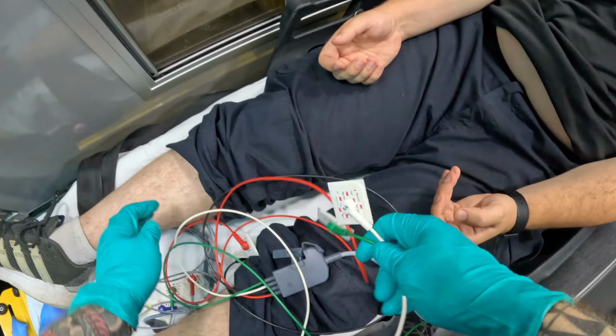You see this button right above print says 12. I'm going to click 12. It's asking me for the patient's age. I already looked at the armband, or you could ask the patient. I know he told me he's 28. Very important you put the correct age for the algorithm. So 28, and then you select male or female, again for the algorithm. So male.